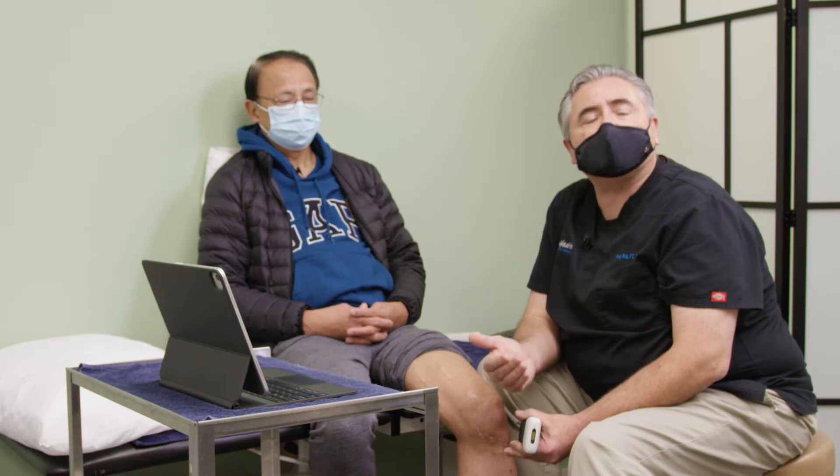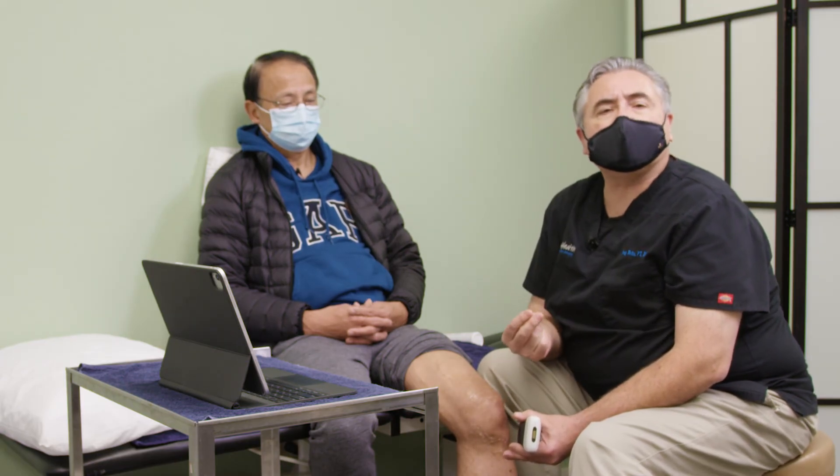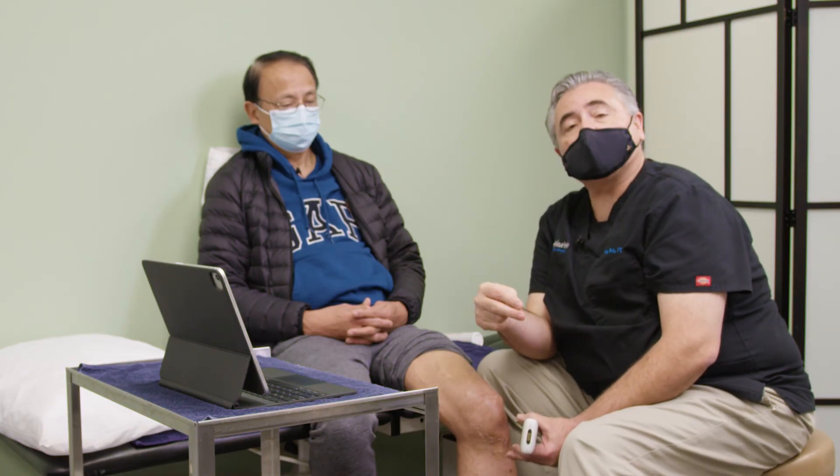In summary after the scan with Orlando, I am confident we don't need to have him scheduled for a knee replacement. Though in the back of my mind, the medial complex of this knee is significantly broken down. There's enough articular cartilage evidence in the trochlear groove and on the femoral condyles that makes me feel confident he doesn't need a knee replacement. My concern is that he has the instability where the knee locks on him. The only thing I can feel is responsible for that is his medial meniscus, which might have some components inside on that side that may be giving him some bucket handle limitation and might benefit from arthroscopic debridement.